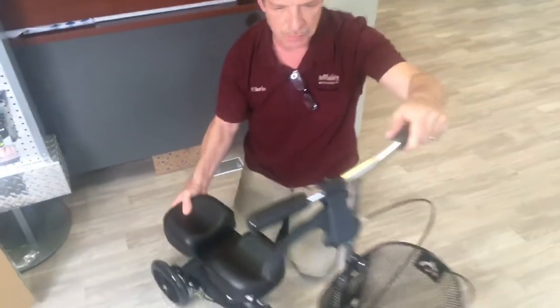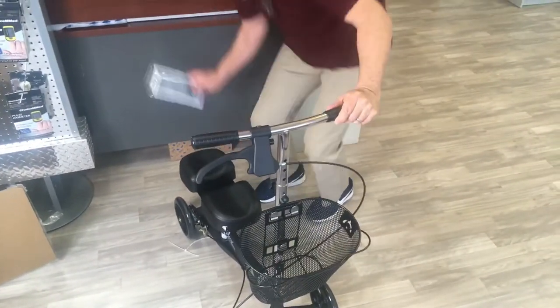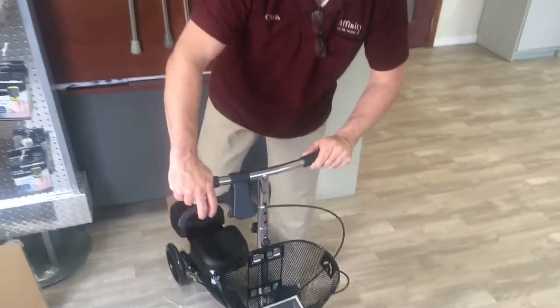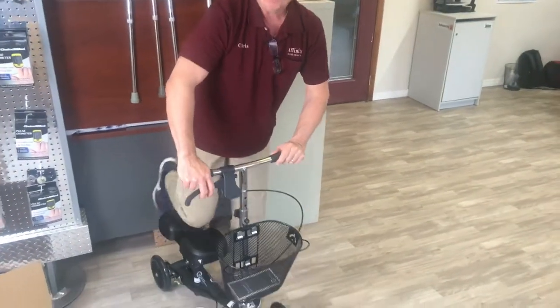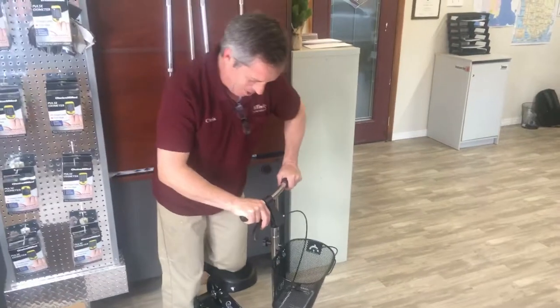The entire knee scooter is now completely secure and ready to go. I'm going to put the instruction package in the basket. We set this for left leg injury — confirmed, we've got it on left leg.